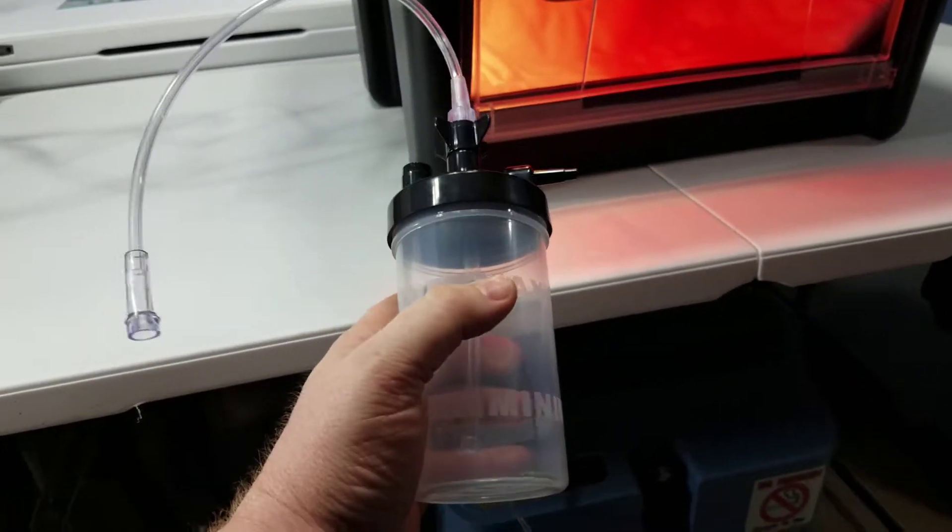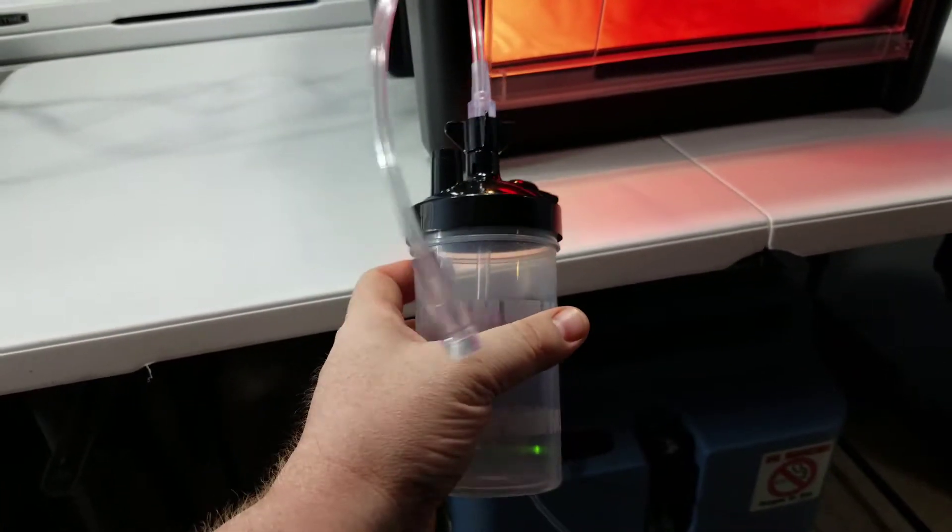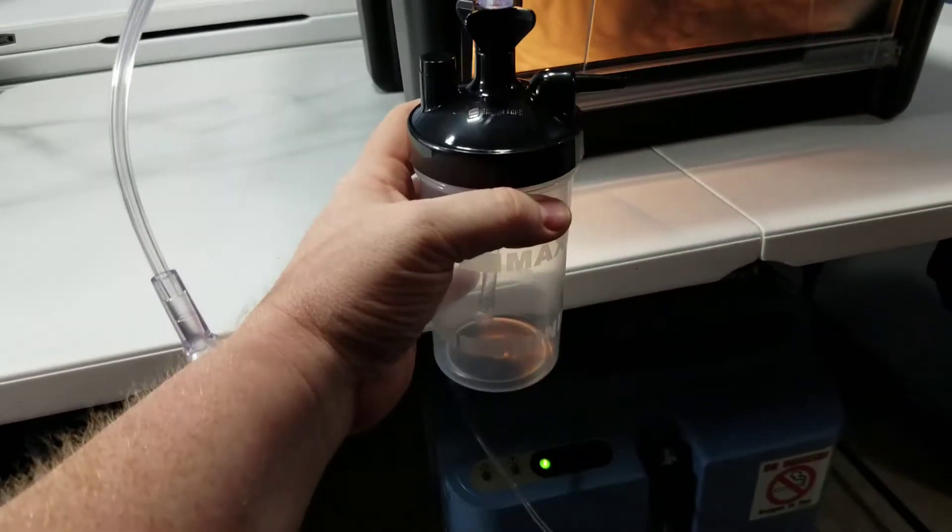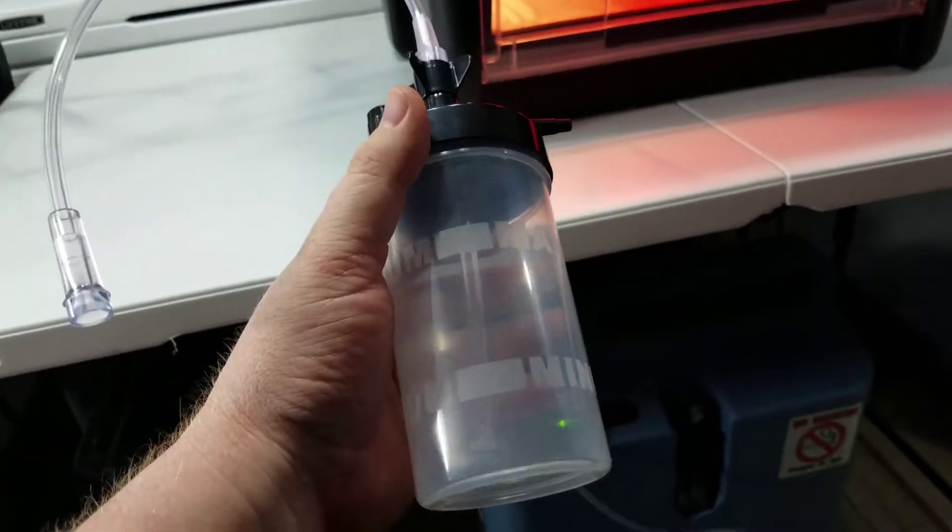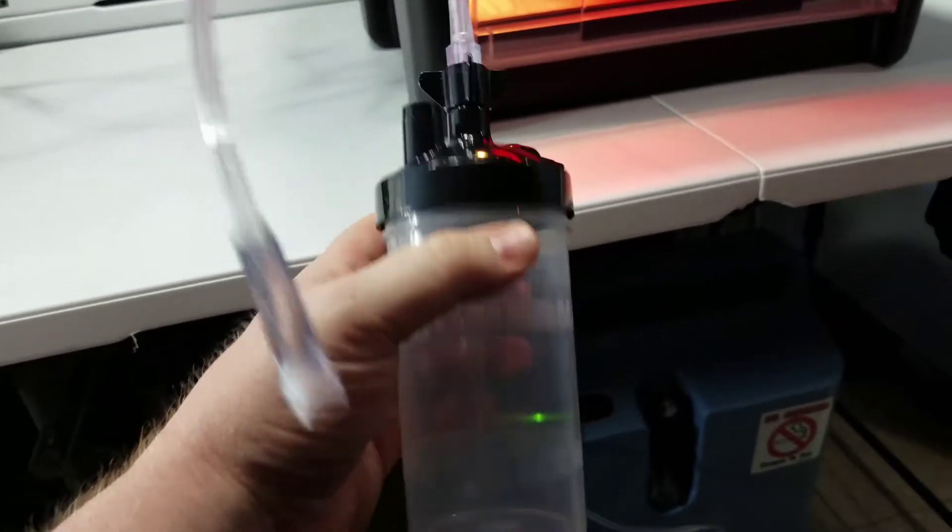Hi, this is Jake from lifelinepetsupplies.com. Today we're gonna cover hooking up a bubbler cup or bubble humidifier to an oxygen concentrator if you want to use that as a source of humidity. Pretty simple to do.